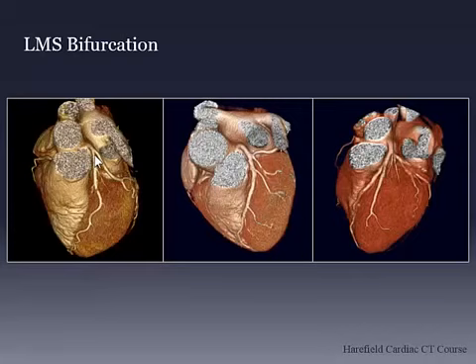They're like, wow, this is amazing. Obviously, the wow factor of CT, it's a few years now that we've had volume rendering. But you still see people saying, oh, that's amazing. And you're like, yeah, whatever. Okay.